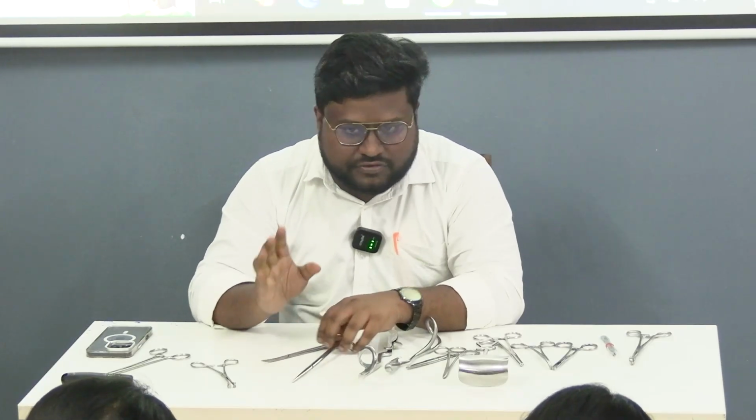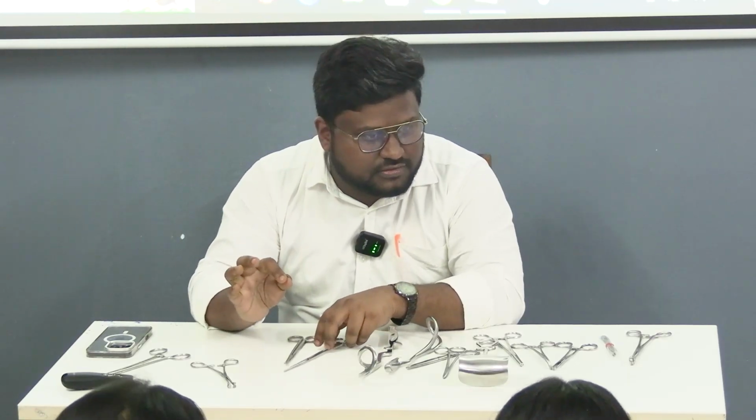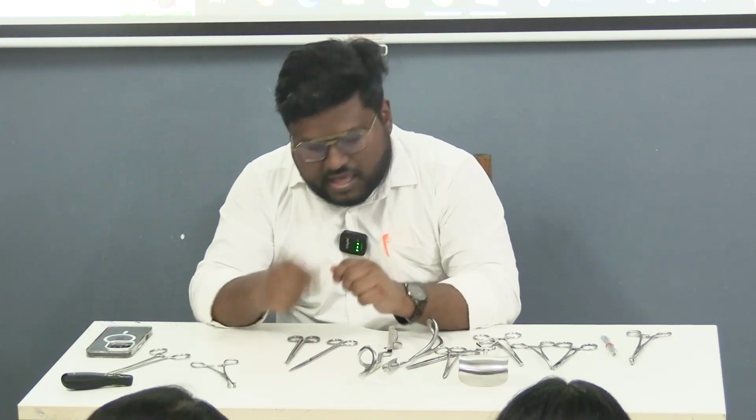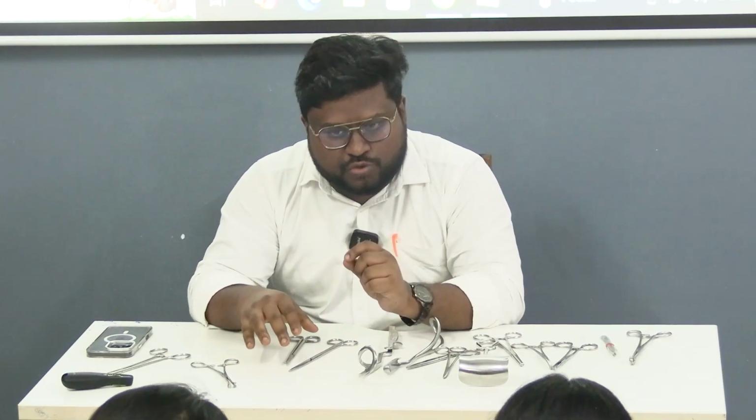ঠিক আছে? Anyways, Vicryl. We use Vicryl for suturing the uterus. We use catgut for suturing other things. Peritoneum or the second layer of uterus, we require catgut suturing. ঠিক আছে? And finally, skin, we do it by ethylon or nylon, or we can do it by subcuticular sutures by a monocryl or a Vicryl rapid, undyed Vicryl. Vicryl normally বিনুনি করা থাকে, braided suture. Vicryl is a braided suture, অনেকগুলো সুচারকে একসাথে বিনুনি করে করা থাকে. It is colored purple. Vicryl is a purple colored suture.